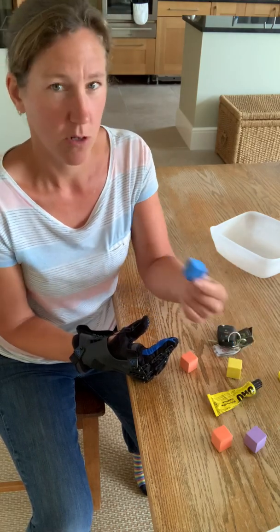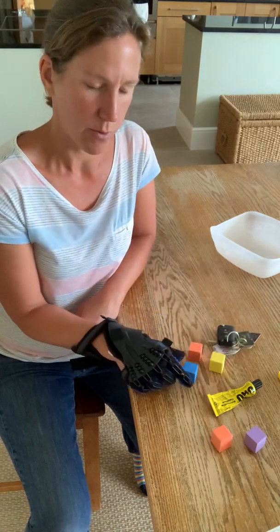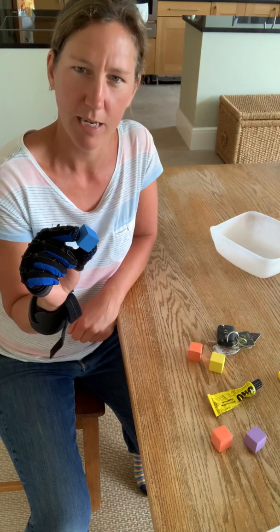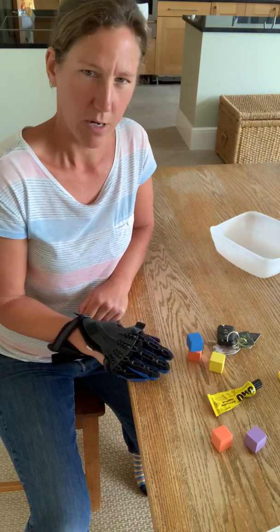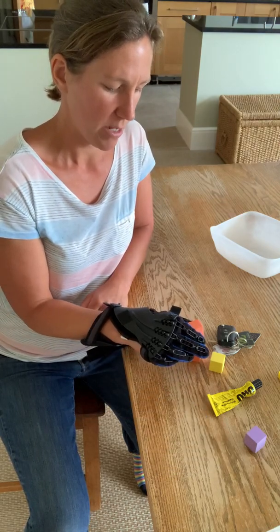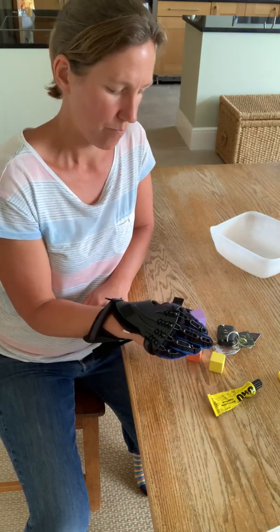You will have got some little cubes with your SaeboGlove. It could be anything you use though, something stackable. These are quite nice for a pincer grip, so that's when it's just your thumb and index finger, or thumb, index and middle finger, and actually practicing stacking one on each other. The higher up you get, you've got to be really controlled with letting go to build that tower.